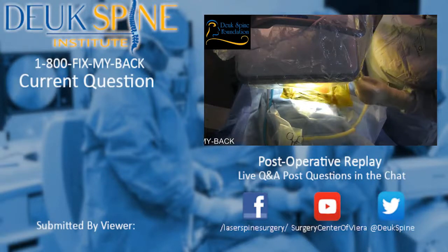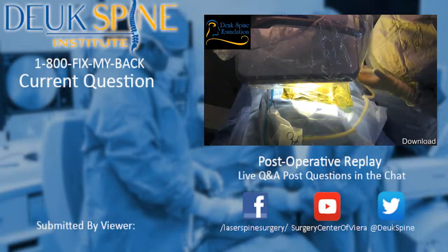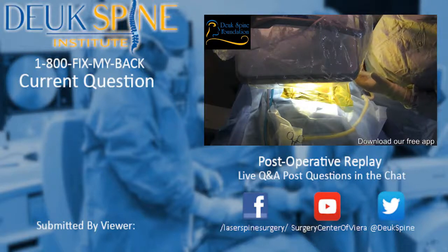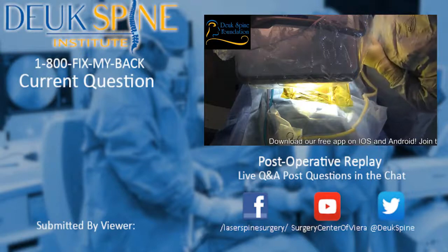Dr. Deukmedjian. All right. So for those of you watching, we just finished a left-sided L5-S1 Deuk Laser Disc Repair. This is a state-of-the-art, most advanced spine surgery in the world for a herniated disc. Unlike traditional surgeries, there is no bone that's required to be removed from the spine.